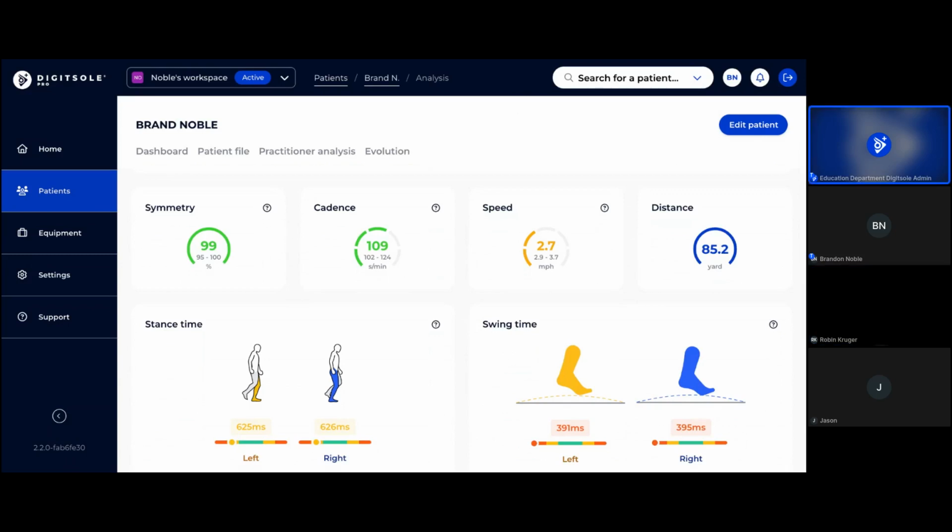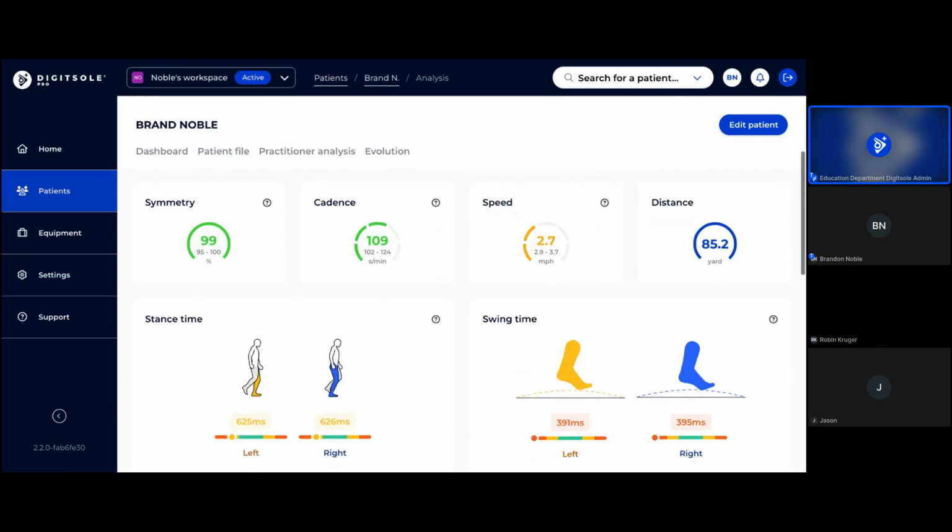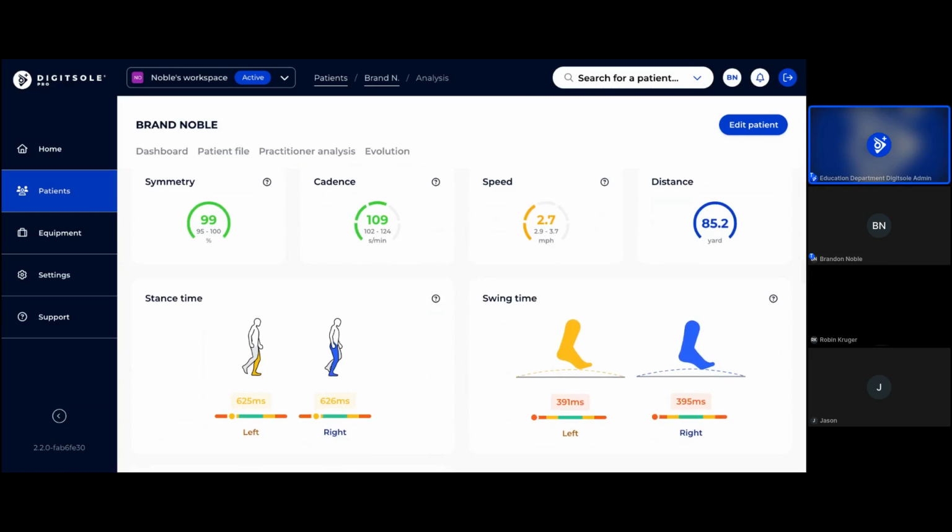And sort of draw your eyes to some of these things that are going to be important. So here's essentially how I would look at this, and I would say, okay, so you're walking slower, and it's slight. So some people may not even notice that, but basically I'll say to a patient, you're walking slower than normal, and they'll say to me, well, I'm in pain. And I would say, no, I get that, but let's put this on paper and let's show some numerical value, because then I can get you out of pain by maybe doing some e-stim or whatever, but you may not actually walk faster as we run through this.